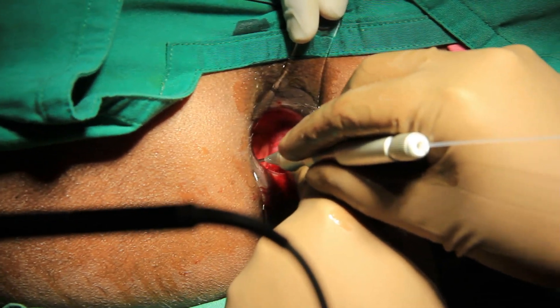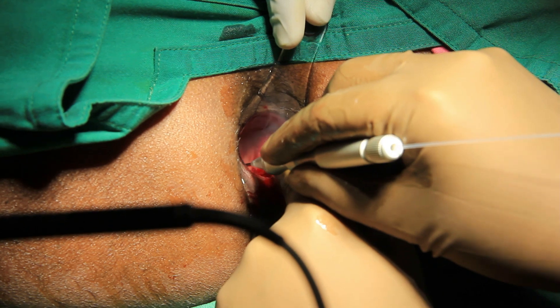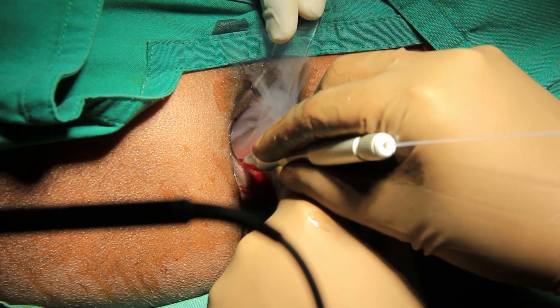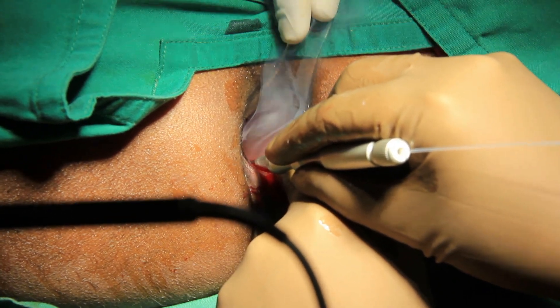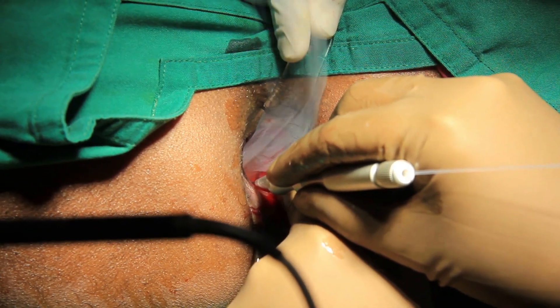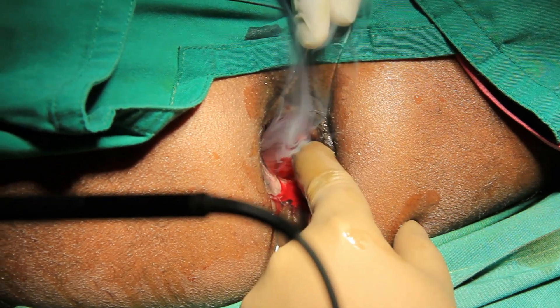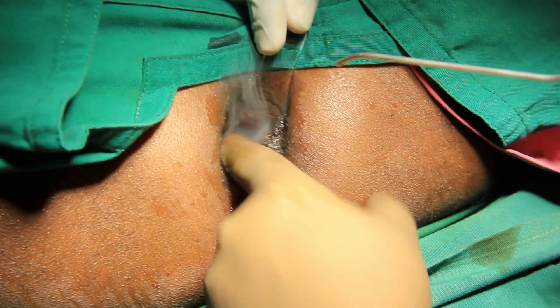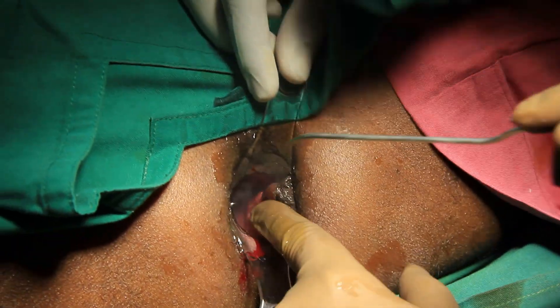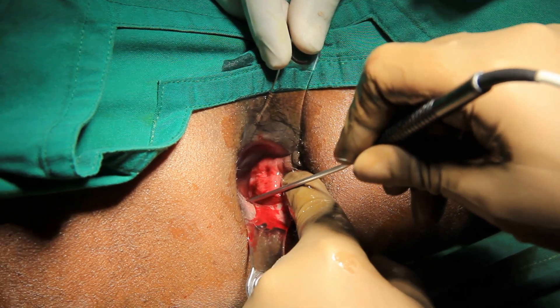On. 10 seconds. Tell me. Just touch it. Yeah. Touching sir. Just touch the mucosa sir. Now check the area — no signal.